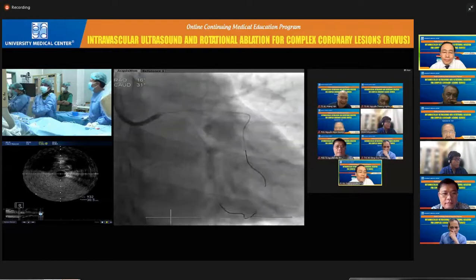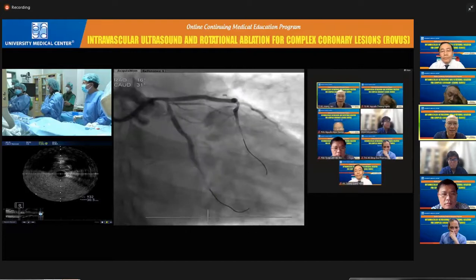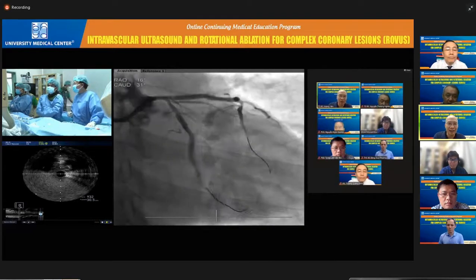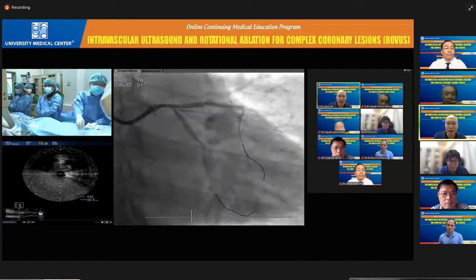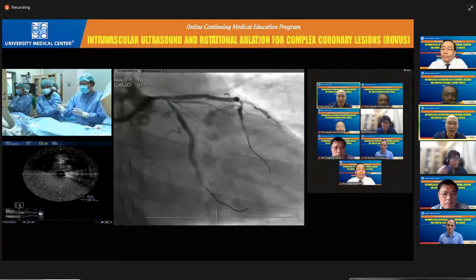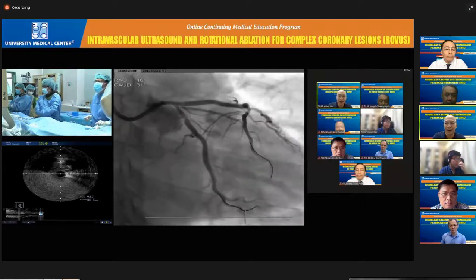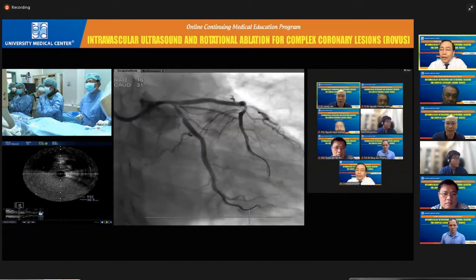Yeah, thank you, Professor Bing. I think this case we should do the FFR. After FFR, depending on the result, we decide to do PCI or not. So this case we need to do FFR. Yes. Thank you.